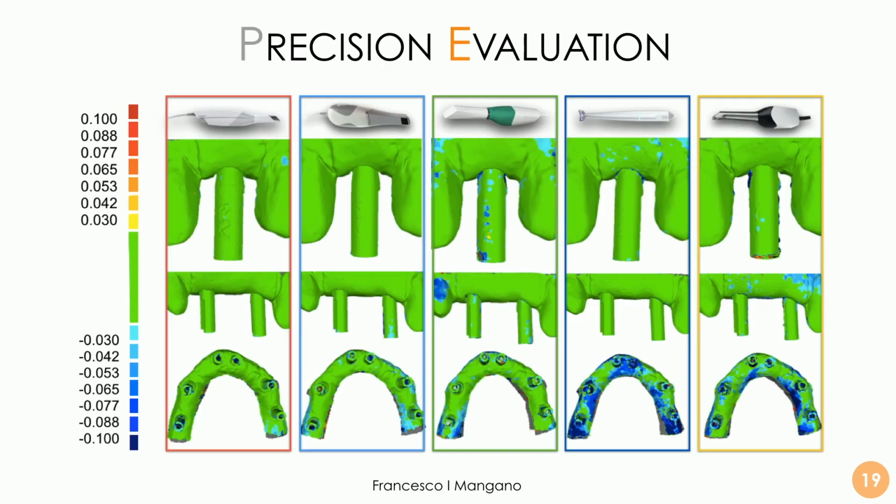But if you watch the precision, already in 2019 we see that most of the scanners were highly precise. The results were highly repeatable. I captured 10 different scans for each of the models, and then I superimposed all these scans on each other to evaluate the precision and the deviations among these different intraoral scans. Among each single group, they were very little, particularly for CS3600, for Trios, and for Emerald. For Omnicam and for the dental wing scanner, we had much more deviation, particularly in the full arch application. That is the more difficult application, of course.